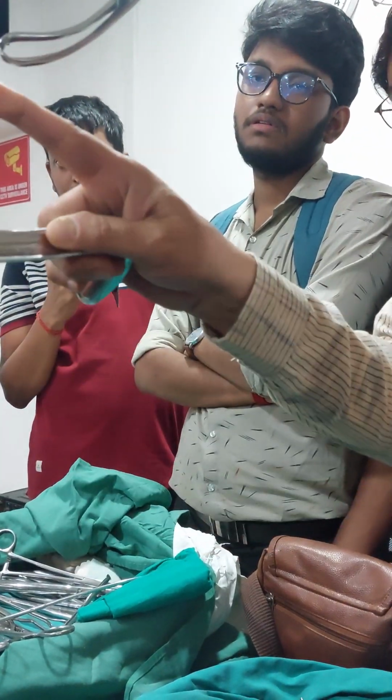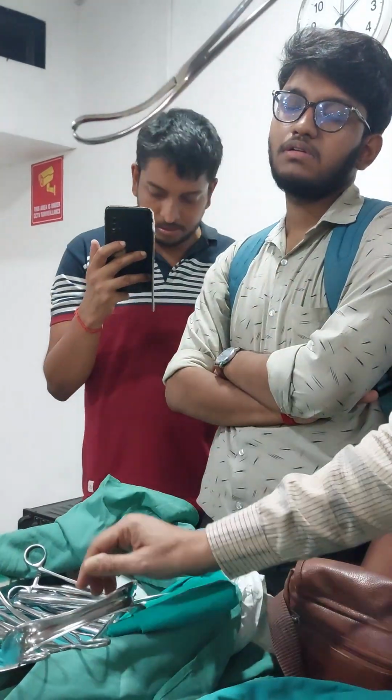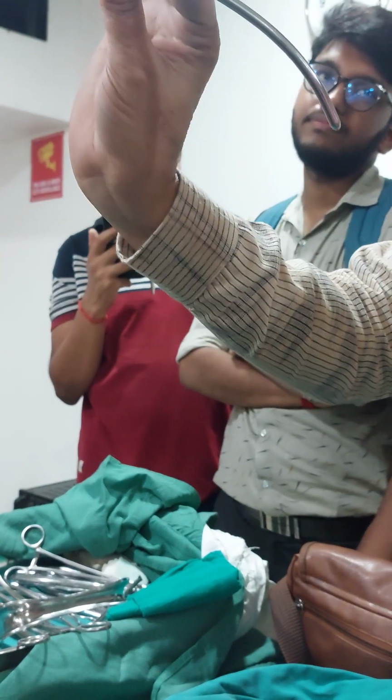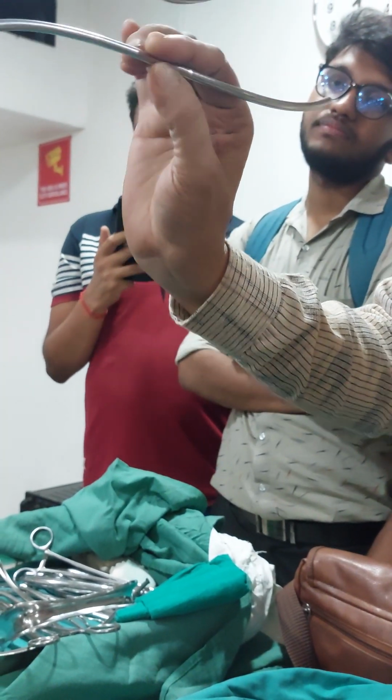Speculum is here. We are seeing the whole external os. Then through the external os, we are putting this dilator like this. Okay. Either an anteverted uterus like this. If it is retroverted, we will have to go like this.